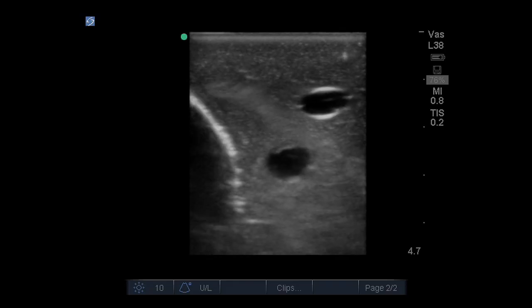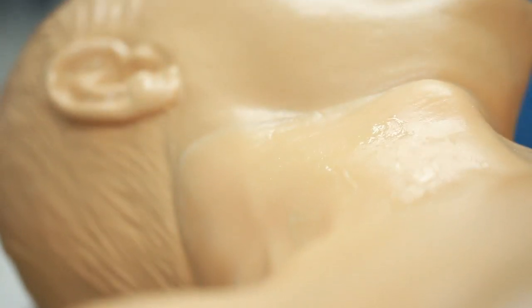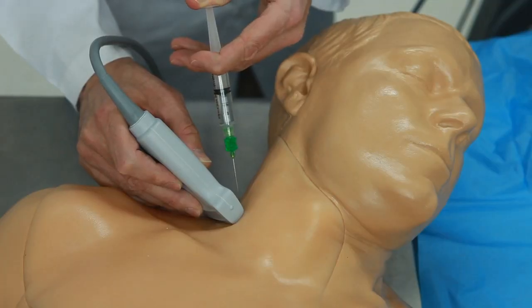The veins are compressible in order to identify the targeted vessels, and we've added the trachea to offer as an internal landmark for regional anesthesia training. We've also added the supraclavicular nerve capability and more tissue area, allowing users to practice the posterior interscalene nerve block approach.